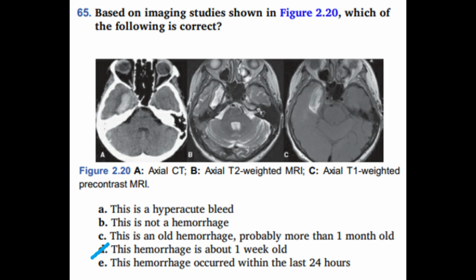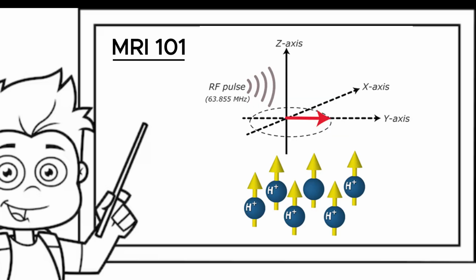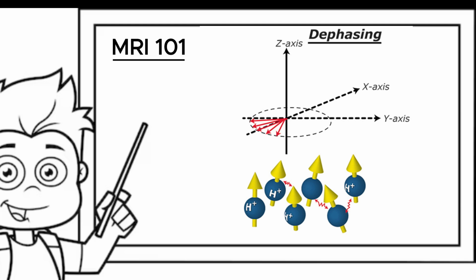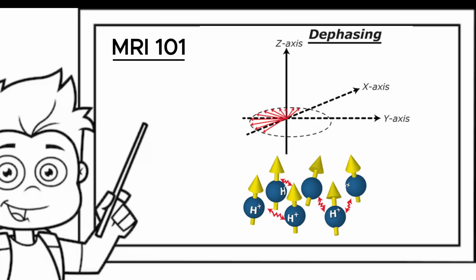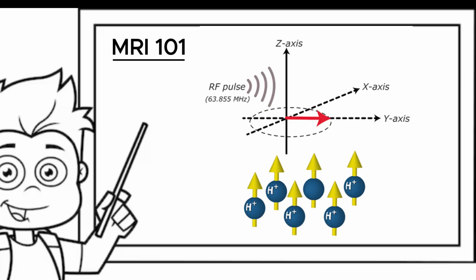We'll start by understanding what the MRI is actually saying. MRI doesn't take photos of the brain like a camera. No. Instead, it listens to how hydrogen atoms behave in a magnetic field. These atoms live mostly in water and fat, and when a magnetic pulse hits them, they wobble, realign, and relax, and we measure that relaxation in 2 different ways.